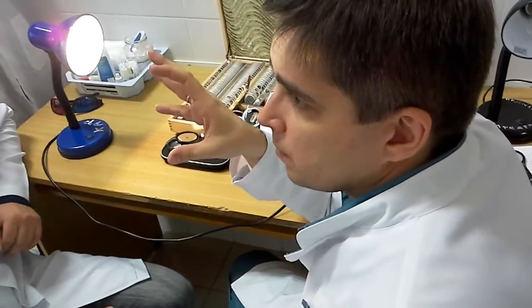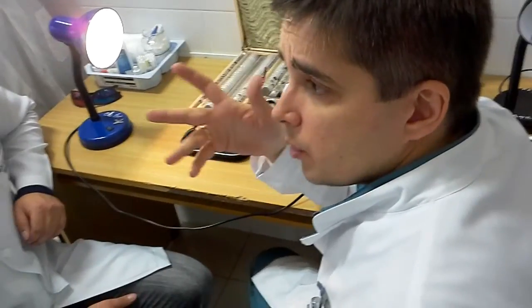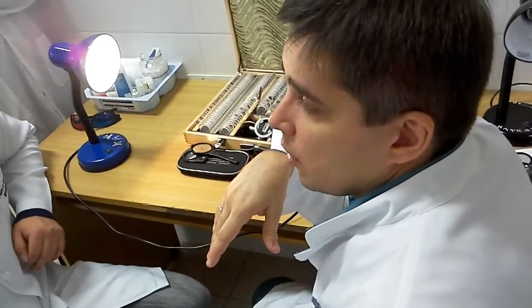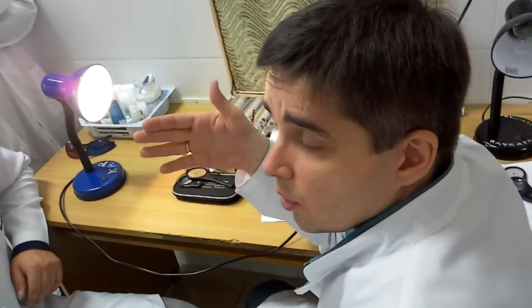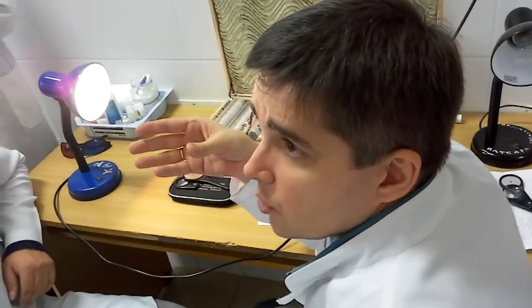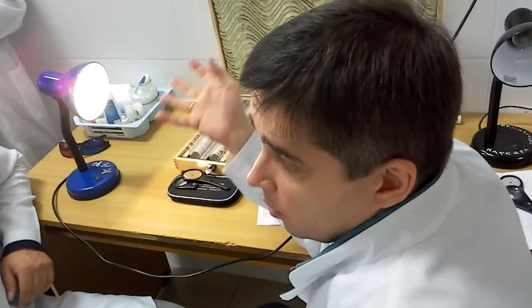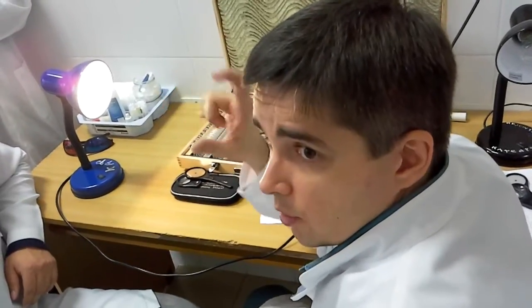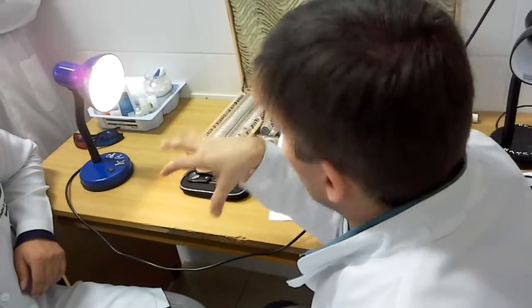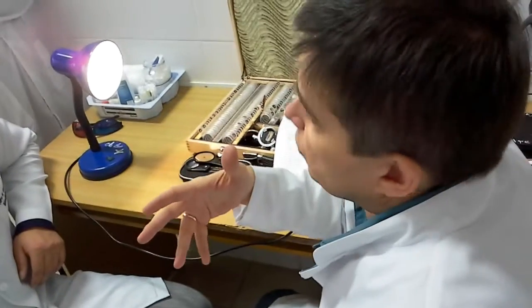If your patient has wrong light projection, in case of cataract, you can suppose that it's not only a problem of the lens. Maybe the patient has a severe problem with his fundus, with his optic nerve and so on. And you can perform surgery, remove the cataract, but vision still will be no vision and wrong light projection. Understand the difference, yes? So now this test is not so important, but it's necessary to know how to perform it.